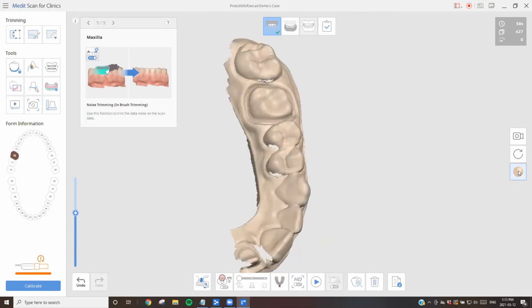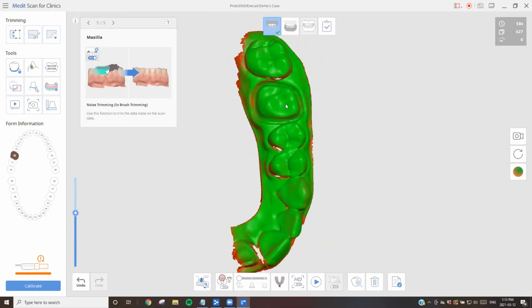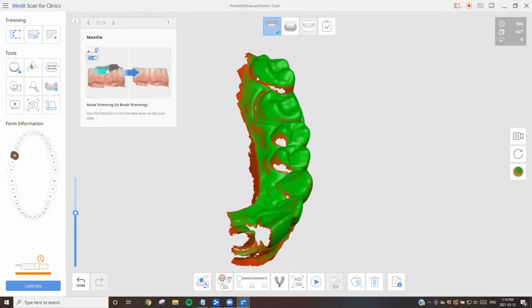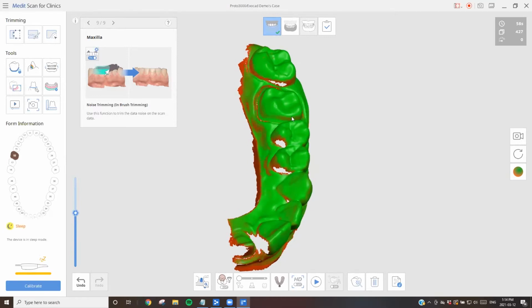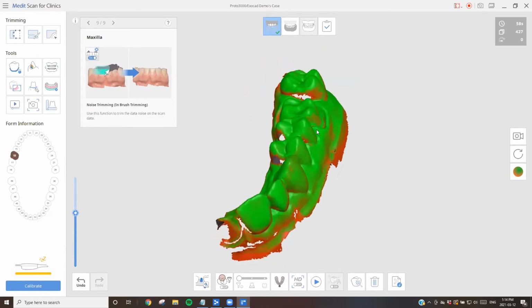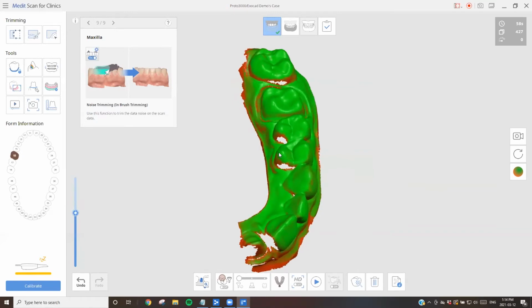One of the great functions is the reliability map. So in this scenario, you're looking for an opaque green, and then you know that this data is ready to be sent out and scanned. Any of the sort of marbled areas, you just need to go over that area again just to double check. So especially areas like contact are very important. I can go back and touch some of these areas up.